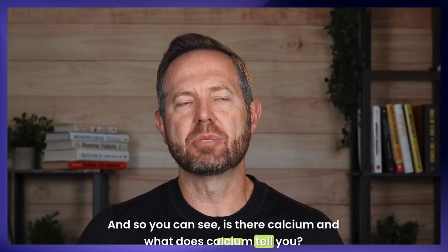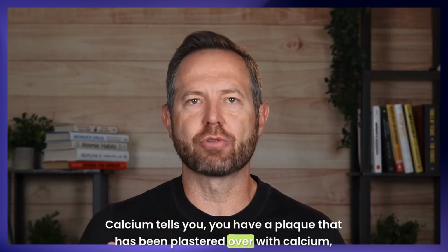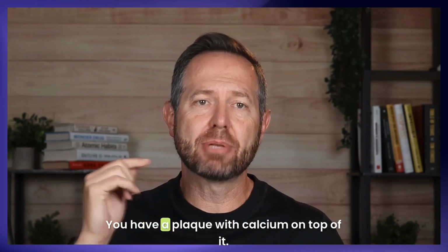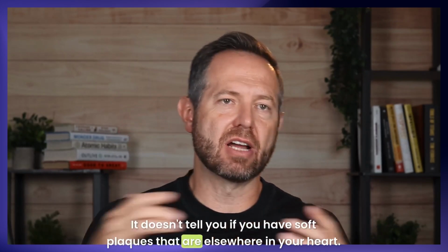And what does calcium tell you? Calcium tells you you have a plaque that has been plastered over with calcium, meaning your body has sealed it off and tried to make it more stable. Now, that's all it tells you. You have a plaque with calcium on top of it. It doesn't tell you if you have soft plaques that are elsewhere in your heart.